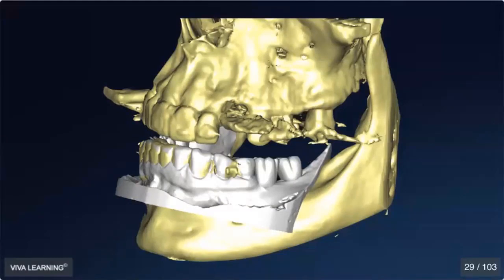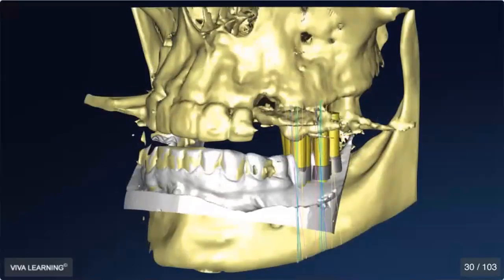When the case is not tooth bound, meaning we don't have natural teeth on either side that we can use as a reference point, whether we have an intraoral scan or even just the CT only, it really kind of falls apart. We can use our classic measurements about how far apart implants need to be, and roughly they need to emerge opposing the opposing ridge. But it gets really, really difficult. And even in an ideal world, in the computer setting, if we take away the ability to have a full diagnostic wax up, then here you go. You can see that these virtually planned implants begin to be all over the place.